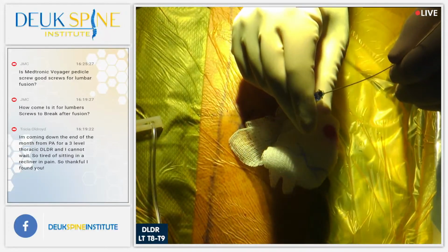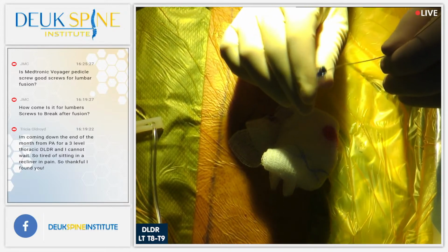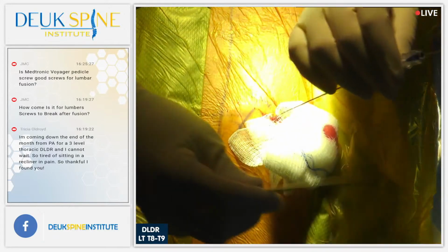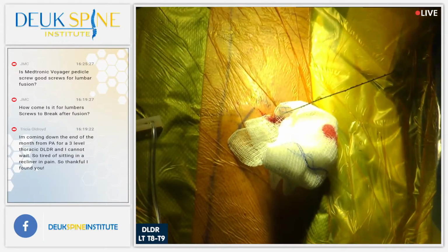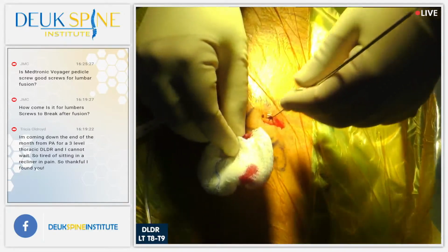That's a 4 millimeter incision I just made. Shot. Now I've got to take this needle out but leave the guide wire. Shot. Okay, good. You guys see that? The guide wire is staying. The guide wire's purpose is to guide me. I'm going to guide this dilator in so we can do the surgery. But we'll take the question.